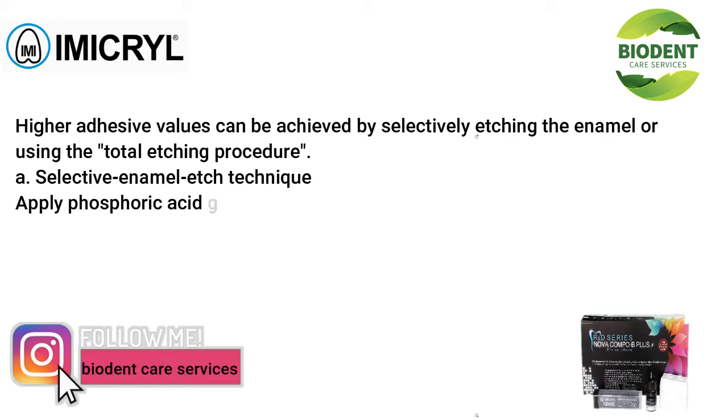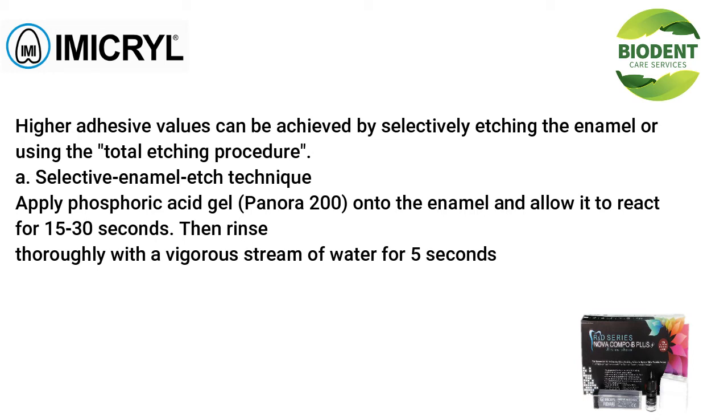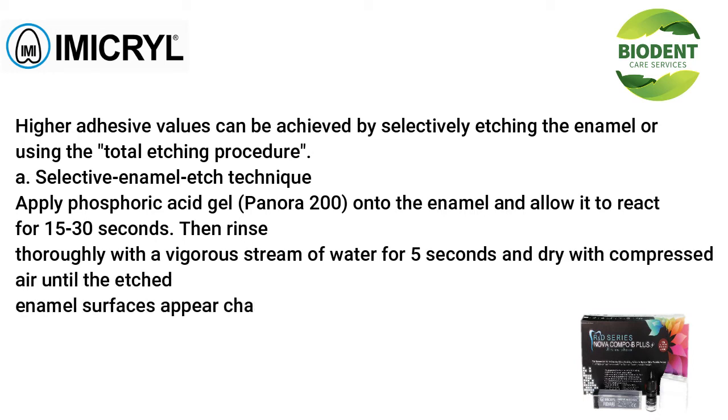A selective enamel etch technique: apply phosphoric acid gel, Panora 200, onto the enamel and allow it to react for 15 to 30 seconds. Then rinse thoroughly with a vigorous stream of water for 5 seconds and dry with compressed air until the etched enamel surfaces appear chalky white. Do not over-dry.